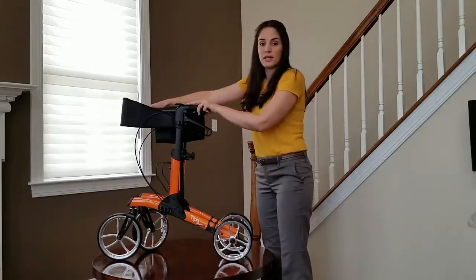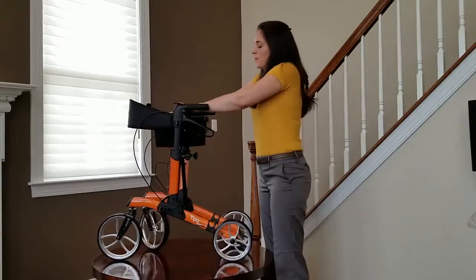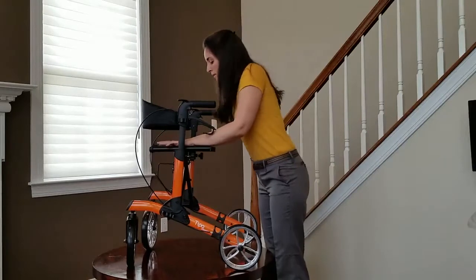Then find the plastic device that is holding the seat together. Open it up and spread the seat apart. Push it down until you hear a clicking sound again.